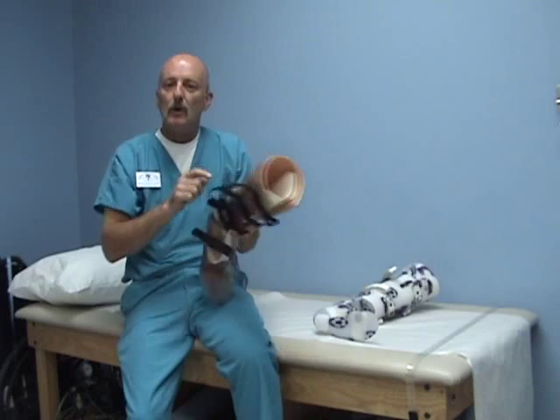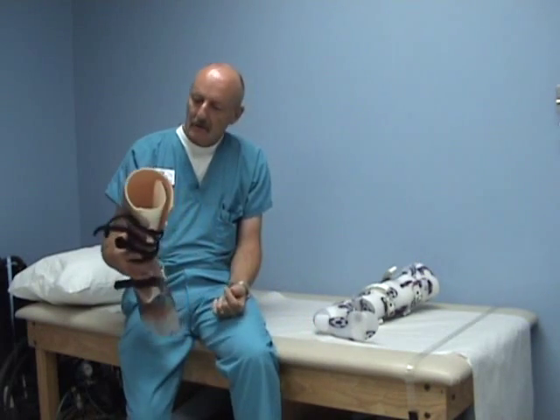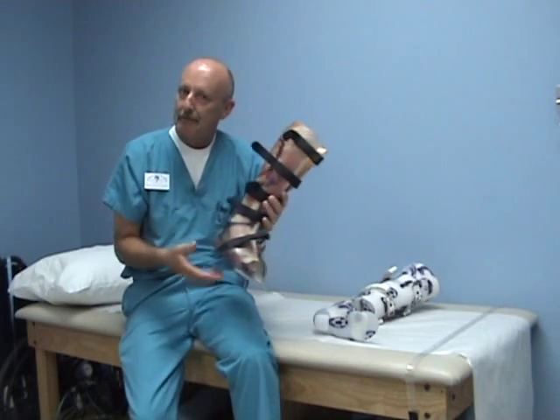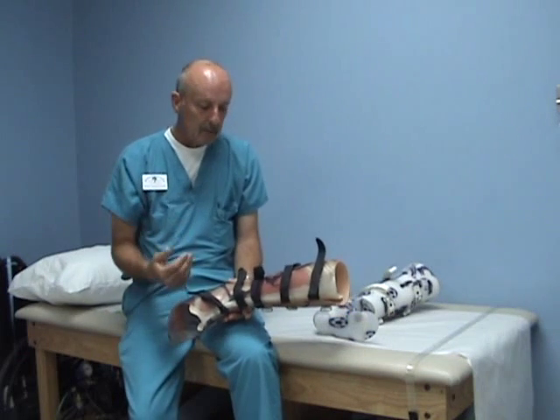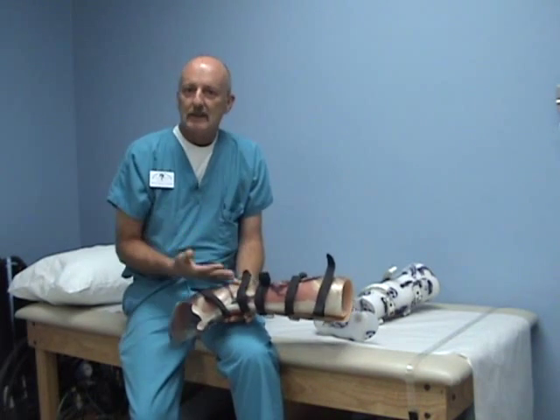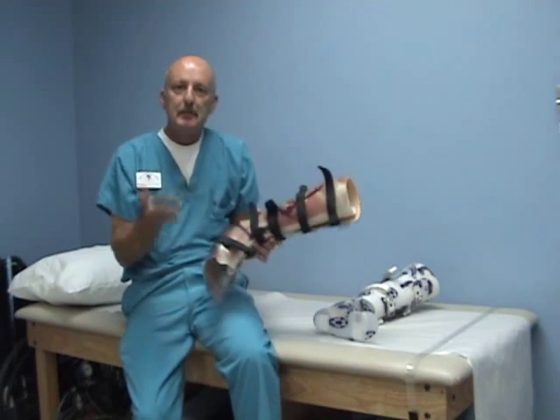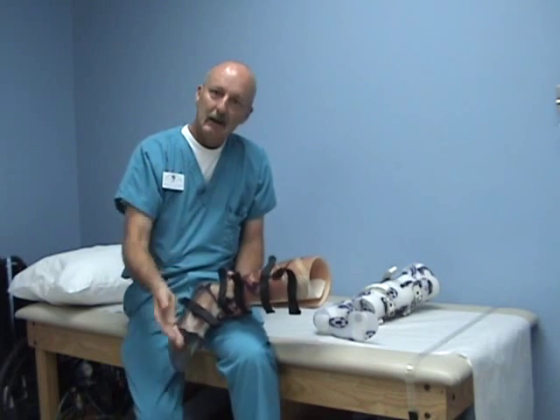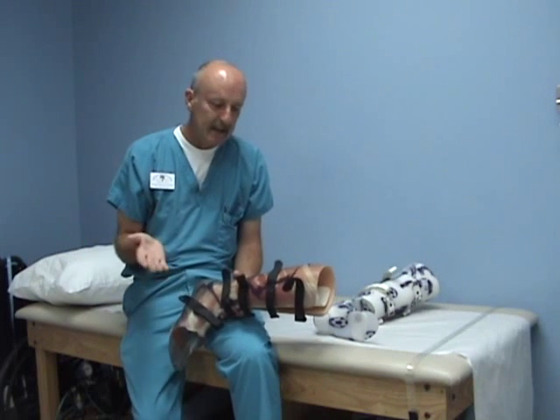You can also put ventilation holes in — I didn't in this one, as this is a sample — but it is a very effective tool at managing and unweighting the foot and ankle. Over the long term, this works like a cast, so a patient is in this for a period of weeks and you have to be able to manage soft tissue fluctuations.